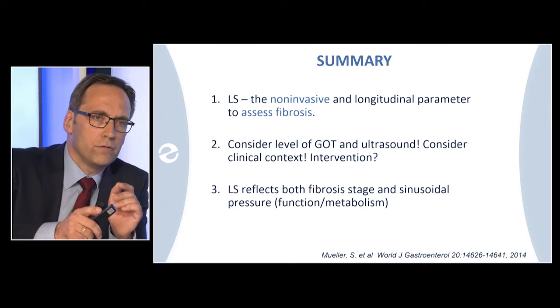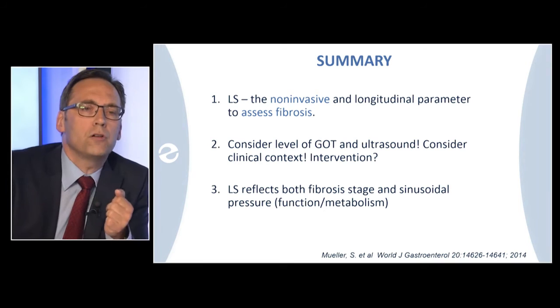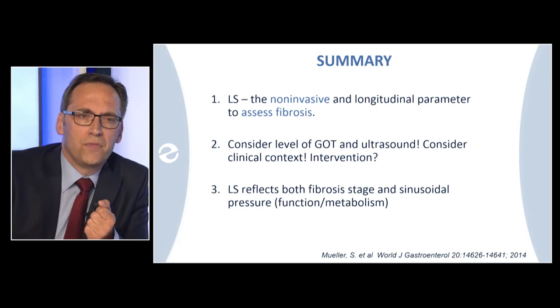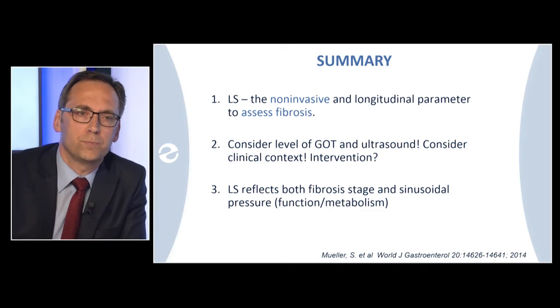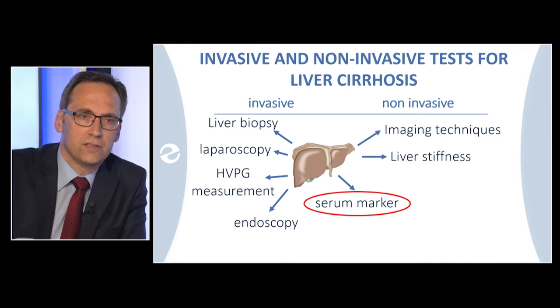Before maybe I hand over, the sum up is, I think liver stiffness is really the non-invasive novel follow-up parameter to assess alcoholic fibrosis. Consider level of GOT, ultrasound, the clinical context, and consider interventions. And liver stiffness, we should always keep in mind, reflects not only the fibrosis stage, but also the sinusoidal pressure and many other conditions. So I would now like to hand over to Ramon.